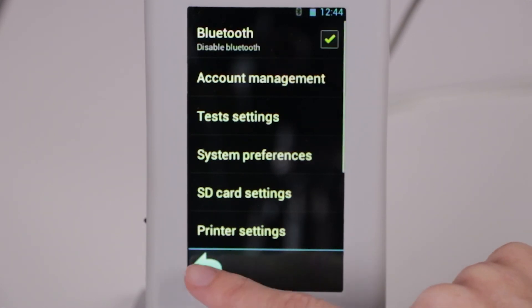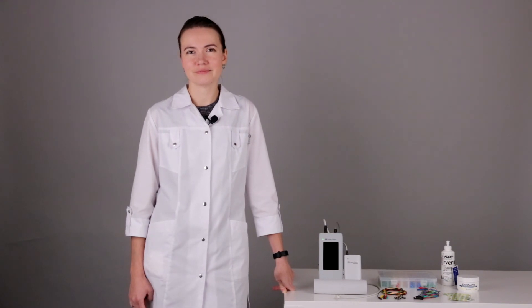Today we have seen how to perform an AABR and ABR test in a baby. I hope this video was useful for you. Thank you for your attention.